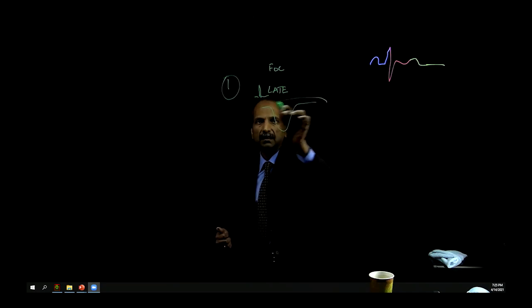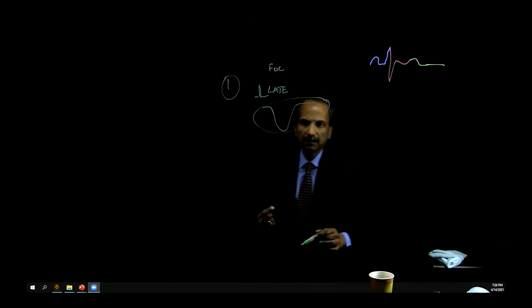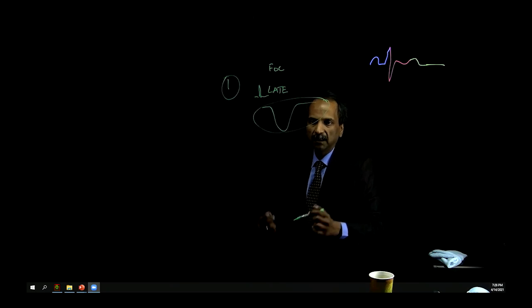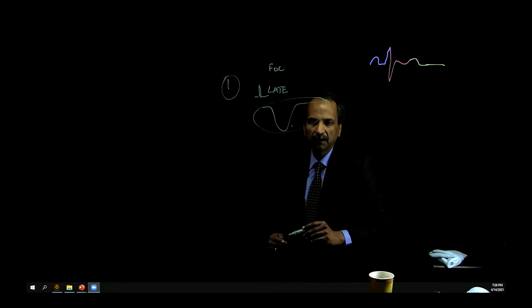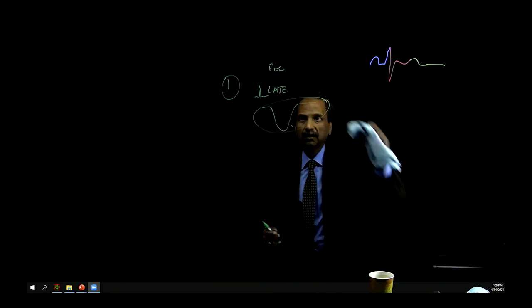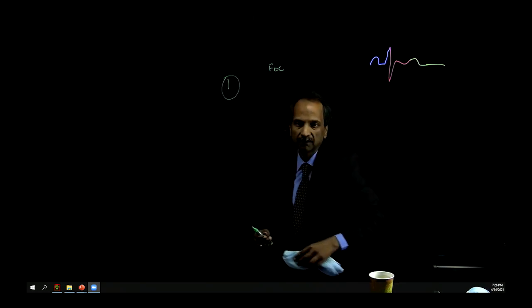Unipolar signal is very sensitive to contact. So if you keep an endocavitary catheter in the blood pool, almost any site will give you all wave fronts going away, for endocardial to epicardial activation, so it's going to show up as a QS. So if you use unipolar, first thing you want to say is, how is my contact? Is the contact reliable? Then you start thinking about using it.